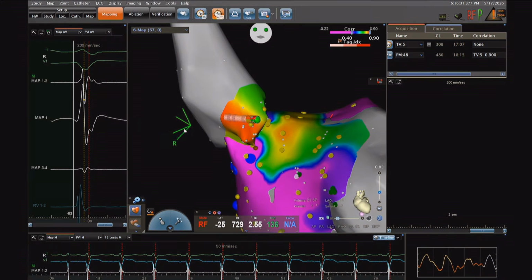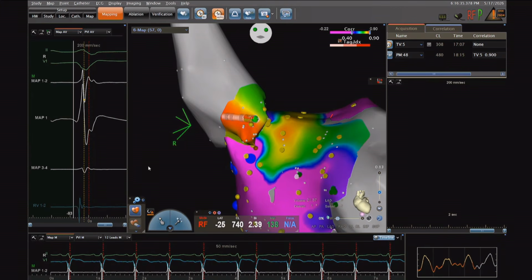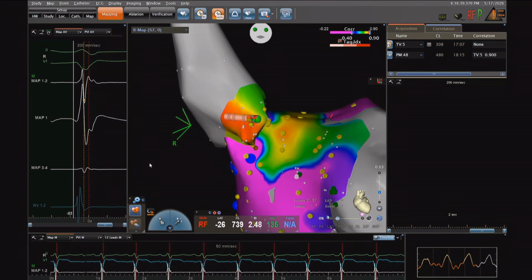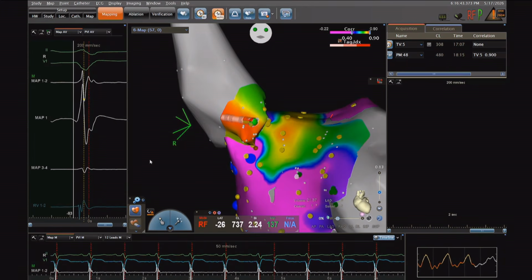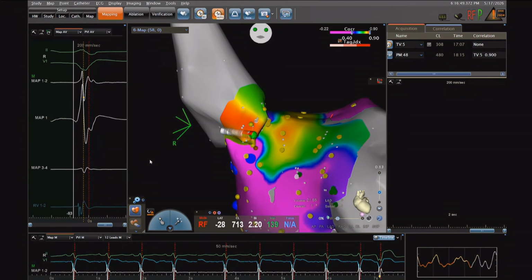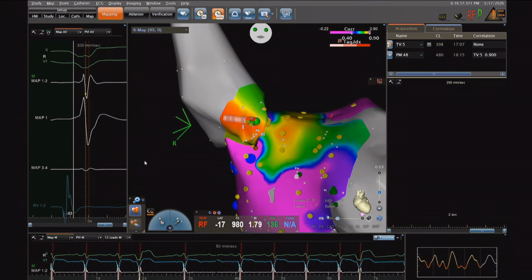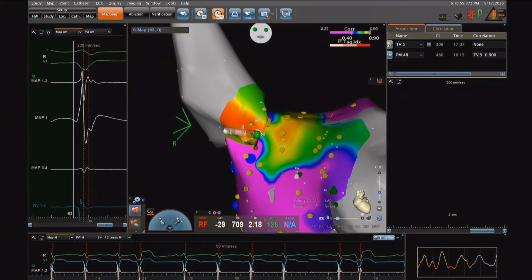So when you see that, it seems that we have some epicardial connection from this side. My question is, when you're pacing from this spot, what part of the heart are we capturing? We are capturing, I think, surrounding myocardium in between right and left, because there is still some extension of septum between both vessels. So we are capturing this area.